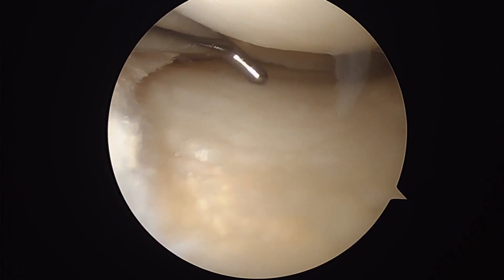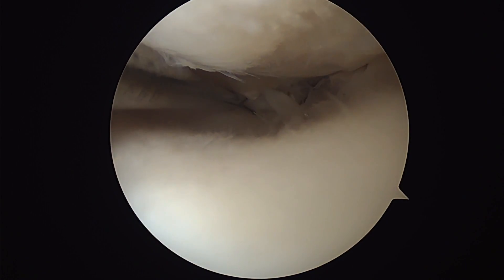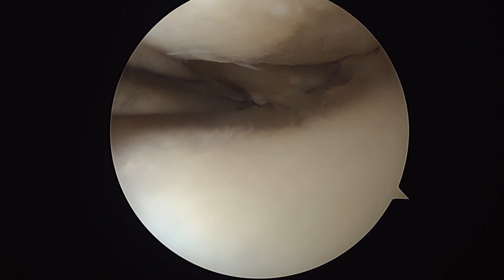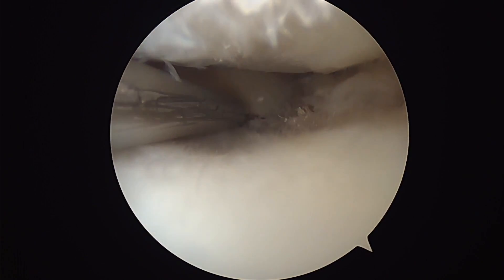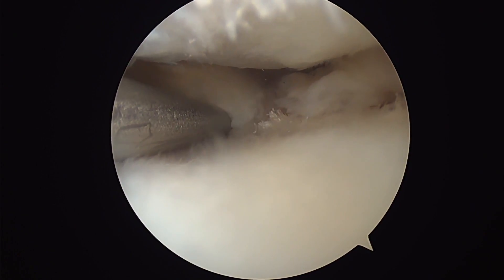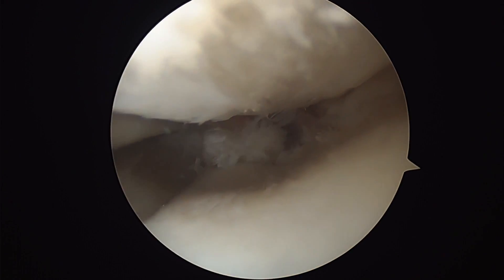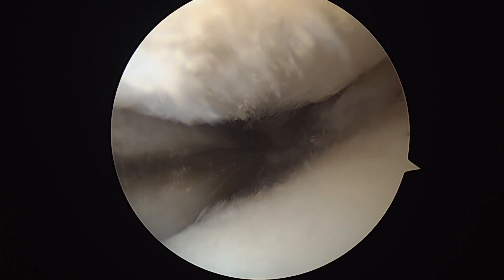The following is a surgical technique video of medial meniscal root repair. This is a 42-year-old active woman with left posterior knee pain of six months duration that failed to improve and ultimately underwent an MRI. Her diagnostic arthroscopy reveals a complete radial tear adjacent to the posterior root insertion of the medial meniscus, and a determination for repair was made.